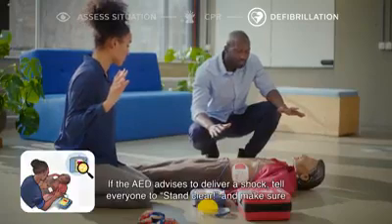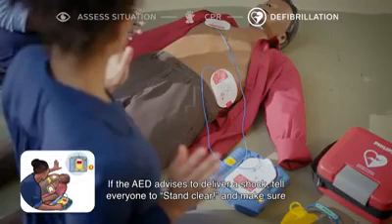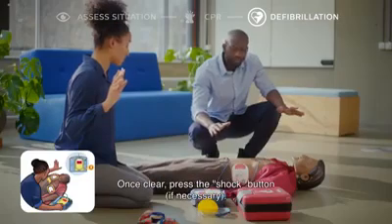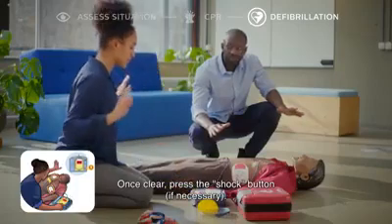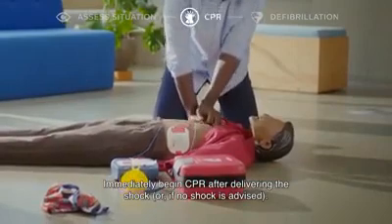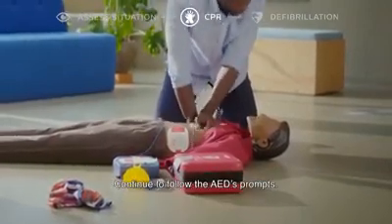If the AED advises to deliver a shock, tell everyone to stand clear and make sure that no one is touching the victim. Once clear, press the Shock button if necessary. Immediately begin CPR after delivering the shock or if no shock is advised. Continue to follow the AED's prompts.